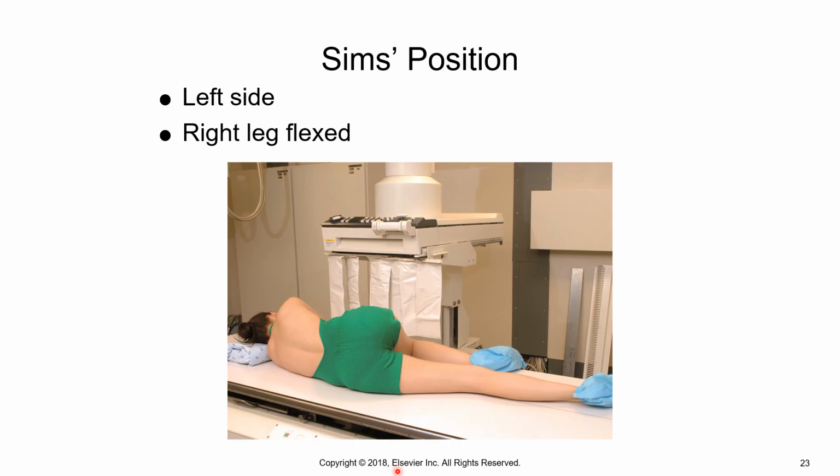Now this exam, recognize this is the only exam where the patient has no clothing on whatsoever. No underwear, no pants, no shirt, no bra, nothing. Mainly because of the area we're imaging, but also if the patient did have any clothing on, I usually have them remove shoes and socks as well. If barium gets on any of their clothing, it does not wash out very well at all. So that goes for our clothing as well.